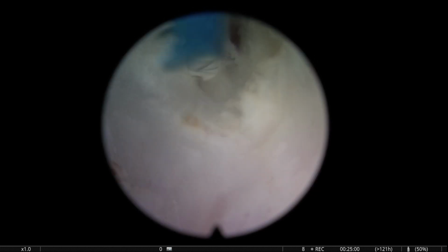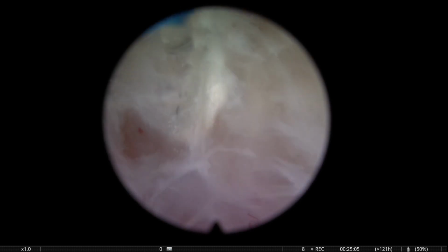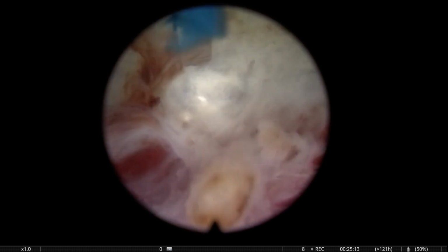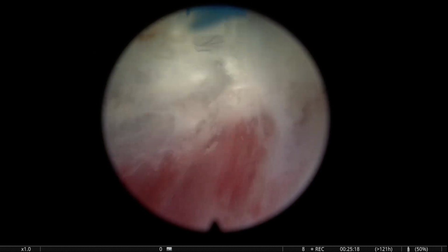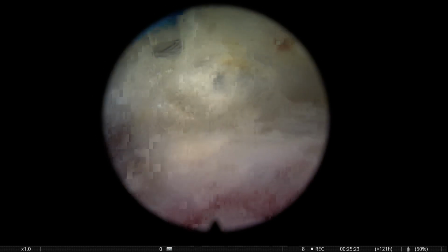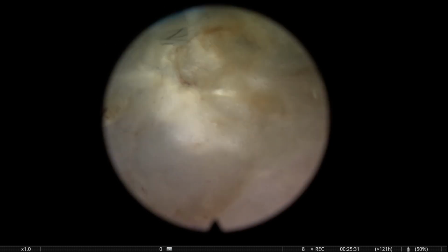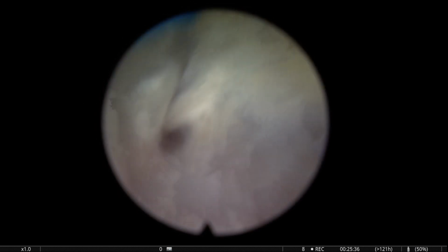Here, for example, is very obvious. I'm firing closer to the adenoma than the line, you see, and I try to keep there because that will help me dissect and carefully separate adenoma from capsule. So you see, if you are calm, if you move slowly, if you are ready to correct your targeting, depending on what you see and the depth of the tissue, you can safely develop these planes. You can safely even explore. That's another nodule, you see.